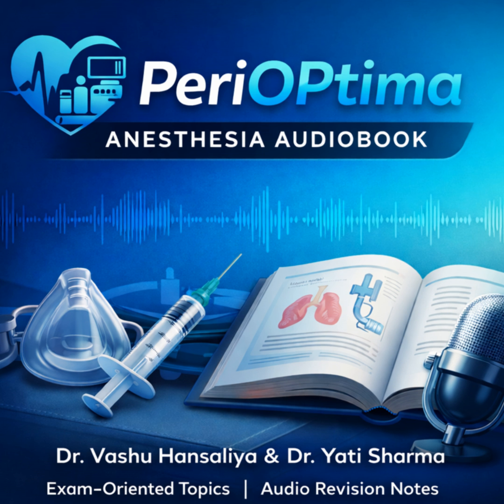Okay, let's bring it all home. Let's summarize the absolute key take-home points for the exam. All right, 1. Mechanical ventilation supports. It doesn't cure. Always start with that. 2. Understand the equation of motion. Pressure has to overcome resistance and elasticity. 3. Know your big 3 phase variables for any breath: trigger, limit, and cycle.